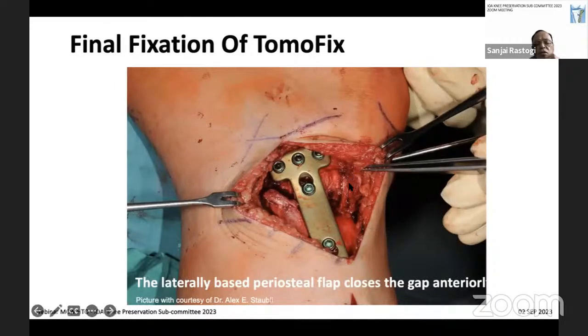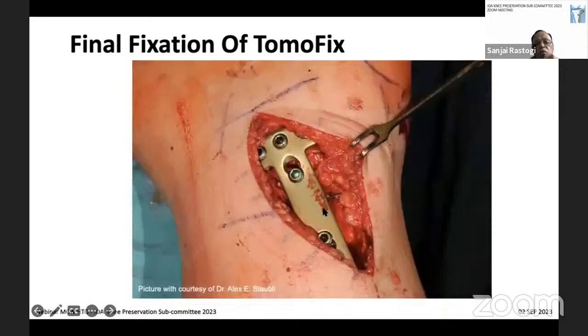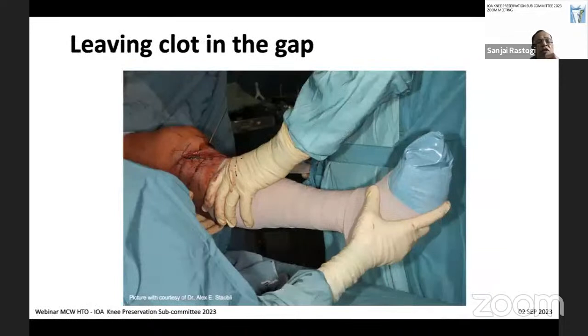The flap which was raised is put into the gap to cover the osteotomy. And this is how it covers the osteotomy gap, and this promotes healing in this large area.